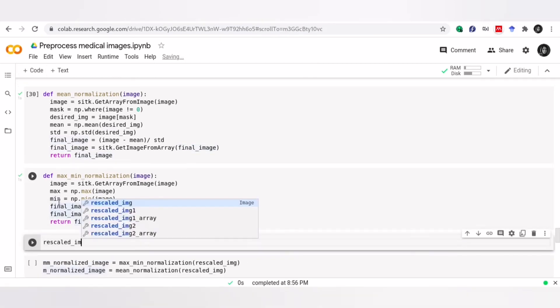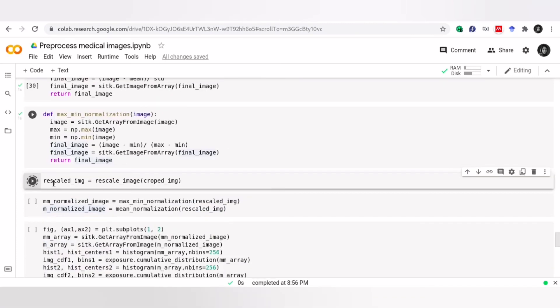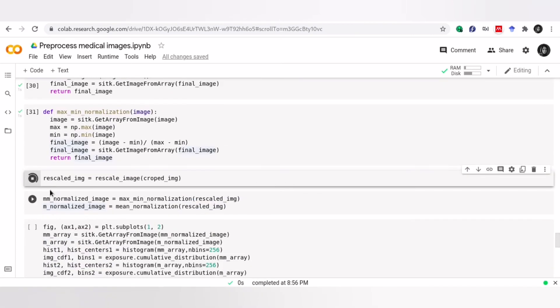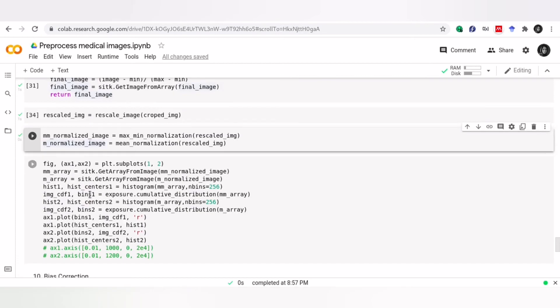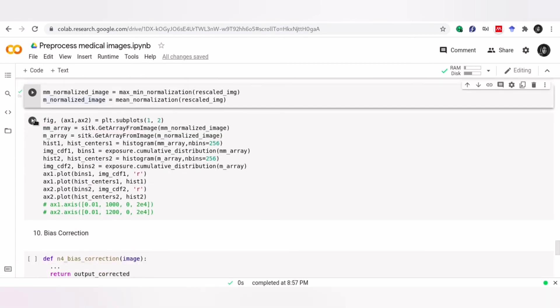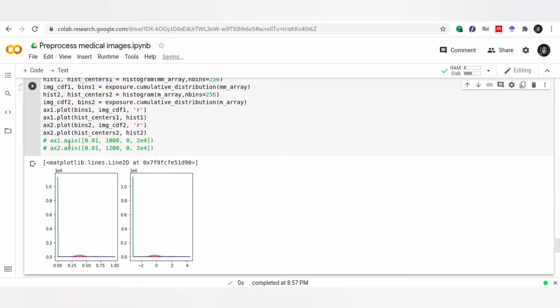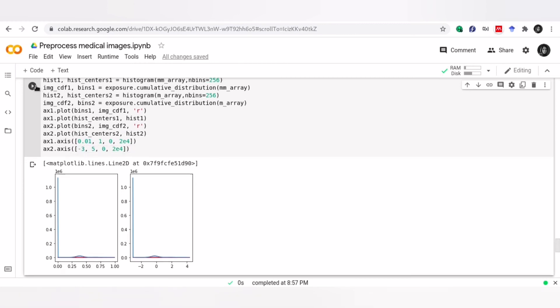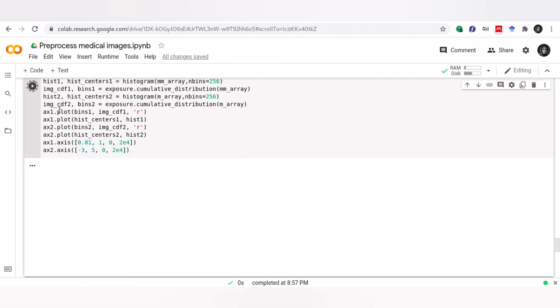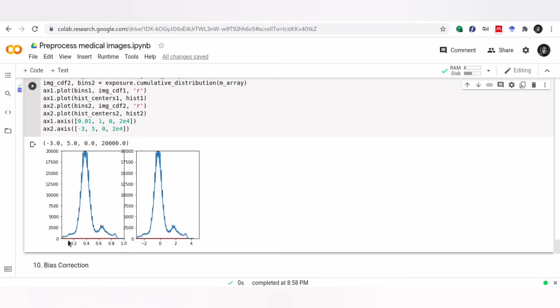In order to check the results, I rescale the image that we have cropped earlier, and give it to our functions. Now we can check what happened to our histograms. Let's zoom to see the histograms better. As you can see, the distributions are the same, but they have different ranges. The left one is between 0 and 1, and the right one has 0 mean and unit standard deviation.